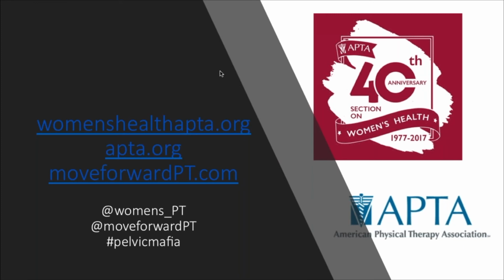I think also looking at it from more of an orthopedic or sports standpoint, any of your athletes, whether they're male or female, who come in with hip dysfunction or low back pain, it's always a great assessment to see what the pelvic floor is doing, see what their transversus is doing. So any active population who you wouldn't necessarily think they have a pelvic floor dysfunction, it's an easy tool to assess those muscles, and it's really helpful when you find those dysfunctions to help progress your treatment.